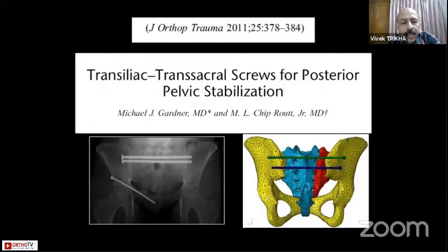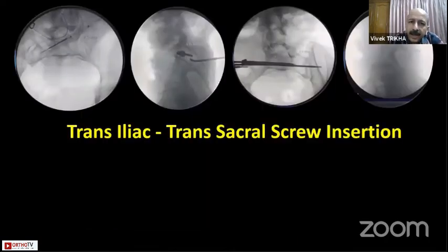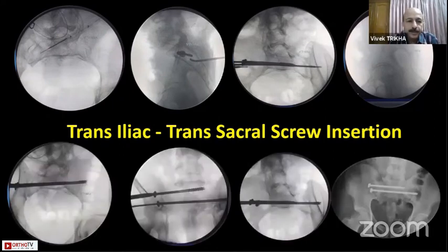There are screws you can convert into transiliac transsacral screws, popularized about 10 years ago. You simply continue further with the same trajectory. In the third image you can see the drill bit on the S2 going right beyond the opposite ilium, putting in a screw that is transsacral, getting a complete hold from one ilium to the other through the sacrum. The only problem is that you require a screw length of around 150 to 160 millimeters, which may not be available, and indigenously developed screws may have strength concerns under stress loading.